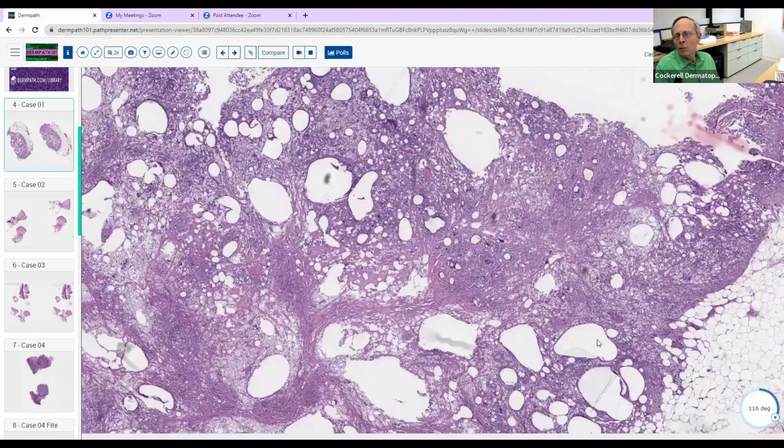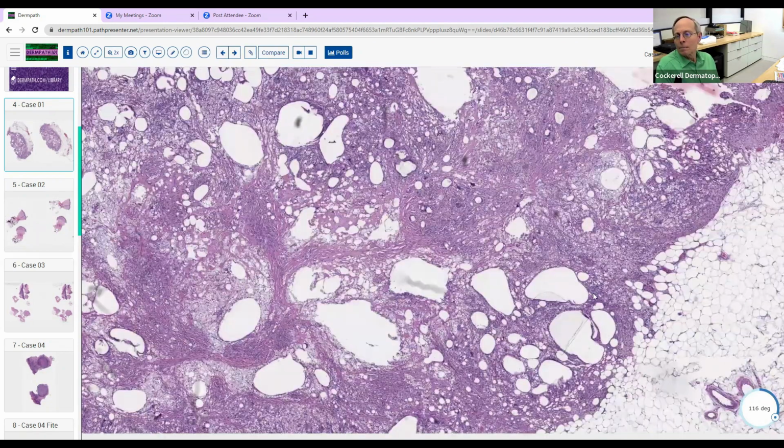You can see all this inflammation here. Here's normal fat, and here's all the abnormal stuff over here. These are so-called fat microcysts. It's almost like emphysema in your lungs. These fat cells degenerate and empty into larger vacuoles, so there are not really lipocytes left anymore here.